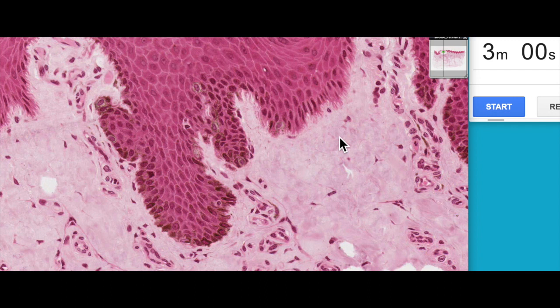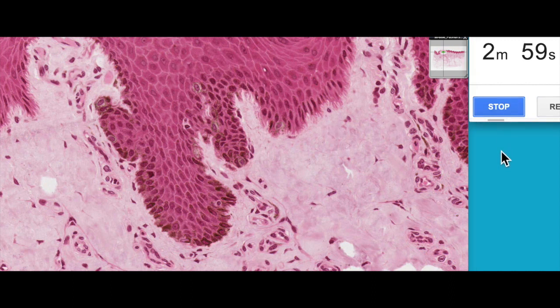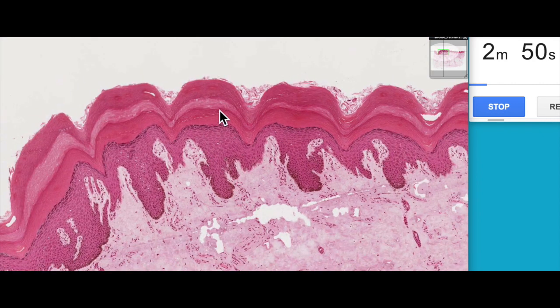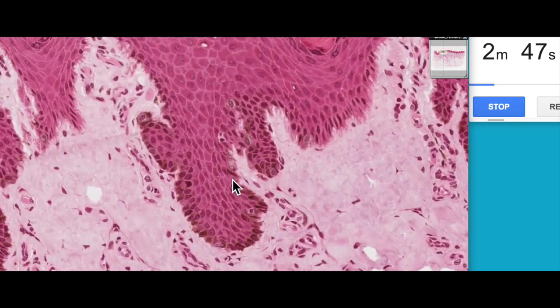We're using a resin section because it gives us a really lovely, nice resolving picture, and then if we've got time we'll try to have a look at a paraffin section. So this is the epidermis — I've zoomed in a lot here. This is thick skin on a resin section, so the resolution is really lovely.